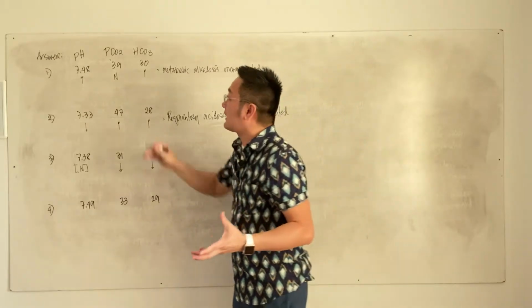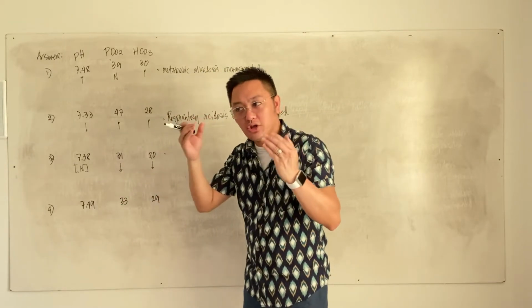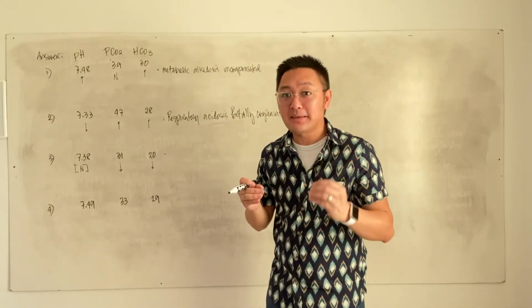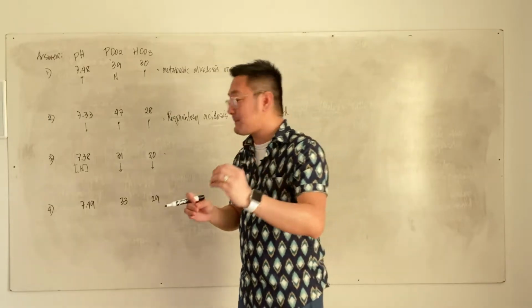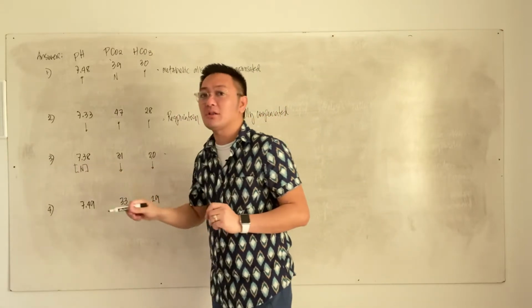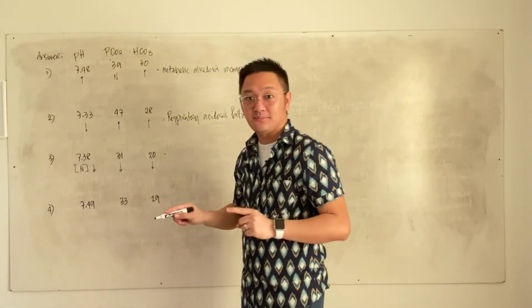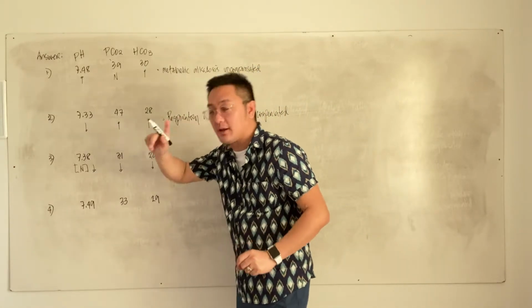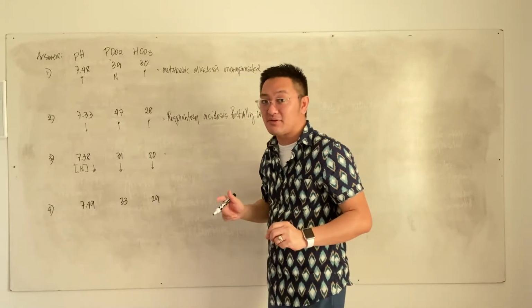But knowing the fact that PCO2 and bicarb have an abnormality and the pH is normal, you know it could be a form of full compensation. And I said, if there is full compensation, your guide there is the mean of your pH. Again, the normal pH is 7.35 to 7.45, and the mean is 7.40. The question here, is 7.38 higher or lower than the mean? The answer, it is lower than the mean. Therefore, that should be in your brain. pH is lower than the mean, but within the range, 7.35 to 7.45.